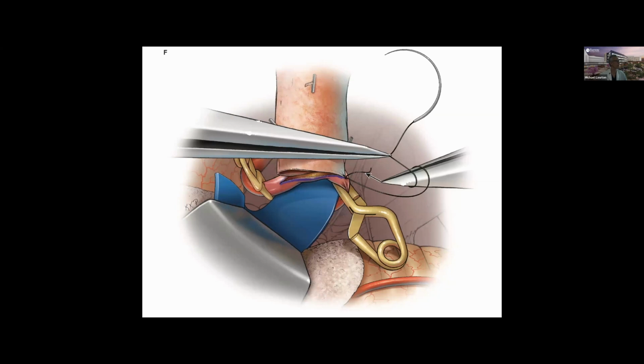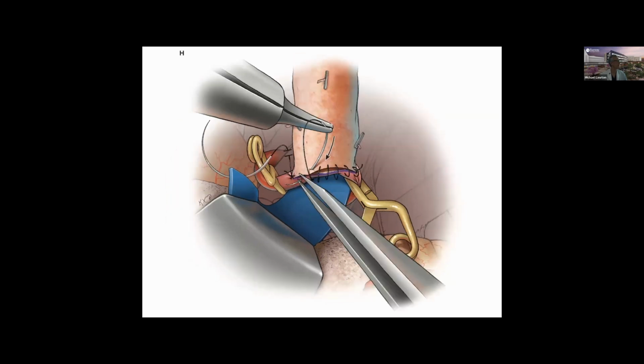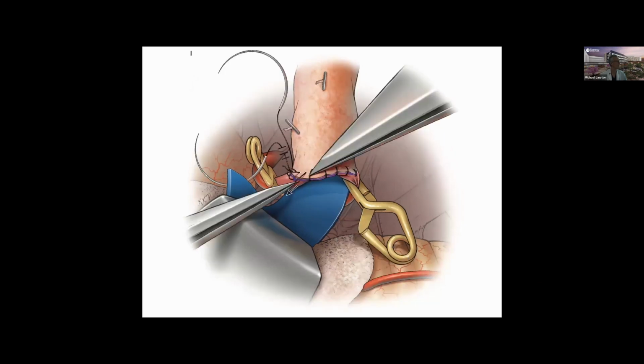Notice the double wrap there. On the other end, you place your other anchoring stitch, and you can see that going in. And then we do our running continuous here from one end to the other. Here now we tighten the loops. If you're just starting out, it's helpful to just keep the loops of suture loose and then go back and tighten them rather than tightening them on the fly. As you get better and you're more focused on your times, you can tighten on the fly.